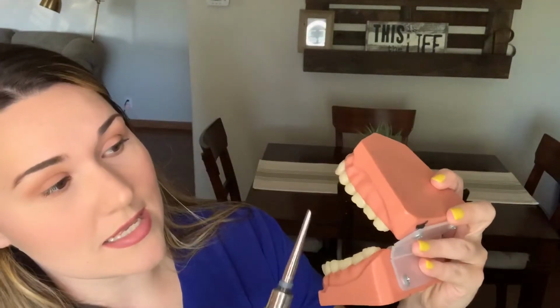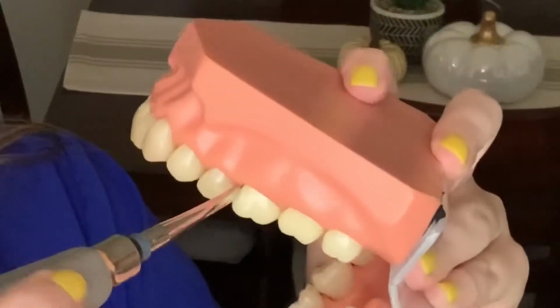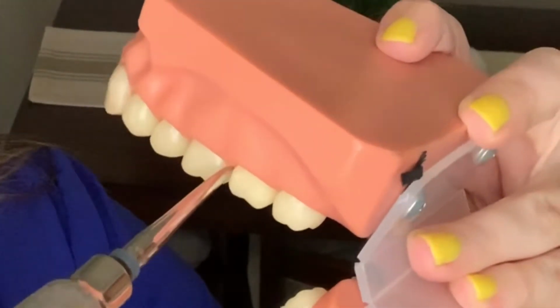Now, he uses elevators to start. Some dentists use luxators, which are very similar to elevators. And there's different sizes to elevators and luxators. So he'll start with a small elevator. This one is on the larger side. I don't actually have a small one, but it just means that this tip is a little bit smaller. And what he will do with this is he will wedge it in between the tooth in front and the tooth we're extracting, and he will put pressure on this tooth to kind of loosen it in the socket. He will do something like this. He'll start loosening it, and he'll go behind it and do the same way.